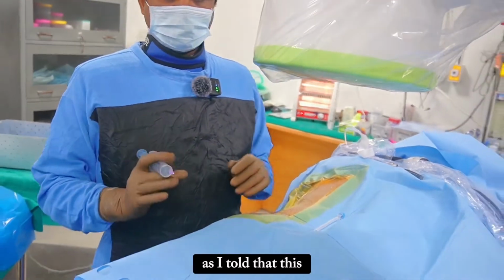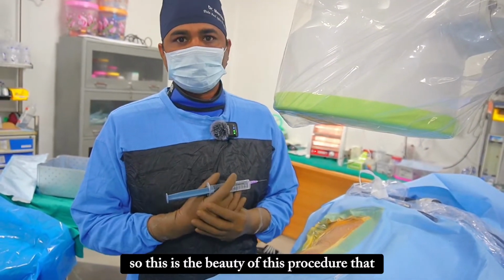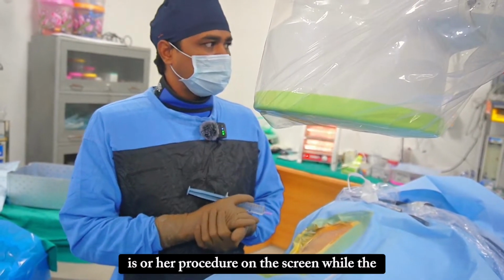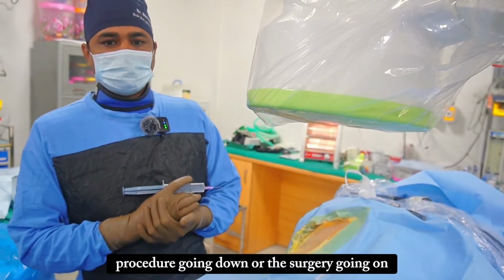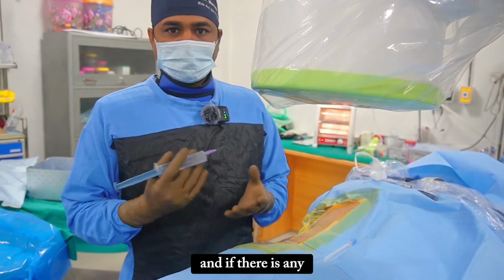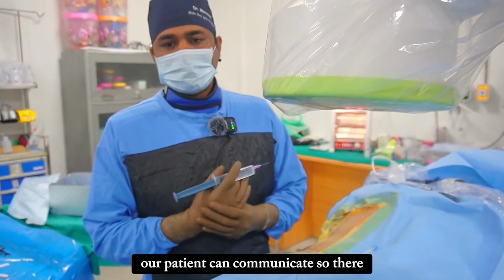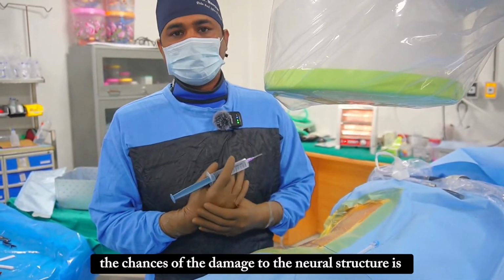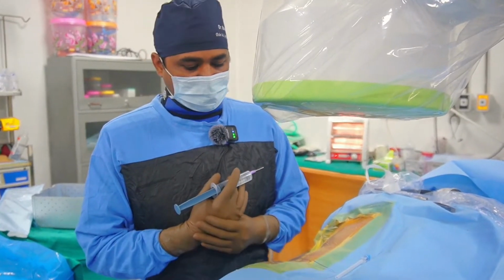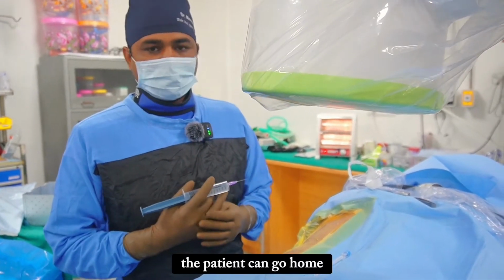As I told you, this procedure is carried out in local anesthesia only. So this is the beauty of this procedure, that the patient can watch his or her procedure on the screen while the surgery is being done. And if we are damaging or touching the neural structure, the patient can tell us or communicate. So the chances of damage to the neural structure are very rare, or you can say very less. Just after the procedure, the patient can walk, or the patient can go home.